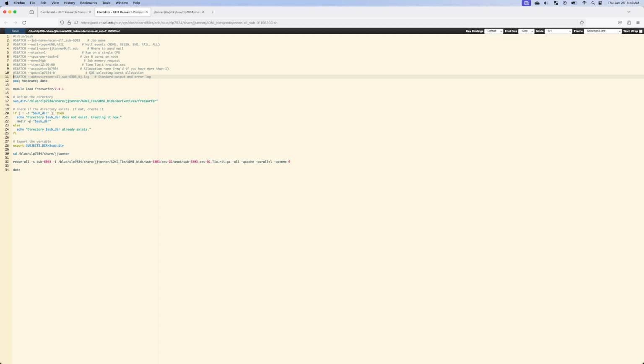So what works on HyperGator, if you're at a different university or you're working for a government or business and they have a similar setup, meaning kind of a supercomputer or high performance, likely they're going to be using the same sort of interacting system. But those are going to be telling the computer essentially how much time you need, how much RAM you need, and different things. So let's walk through those.